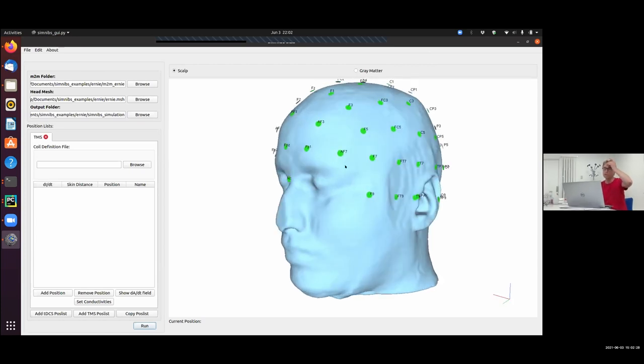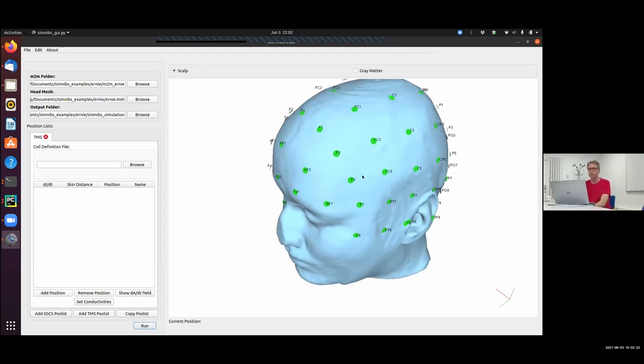What would you suggest for targeting white matter bundles? I think it depends on whether you want to do a TMS stimulation or an electric stimulation. It's relatively clear that with transcranial electric stimulation, when you go high enough in intensity, you hit white matter as the first thing. This was demonstrated in the very beginning of modern transcranial stimulation by Merton and Morton, in 1980 or so. The only thing is that you need to increase intensity to reach a threshold electric field strength where excitation of white matter bundles, so really inducing action potentials there, is likely.